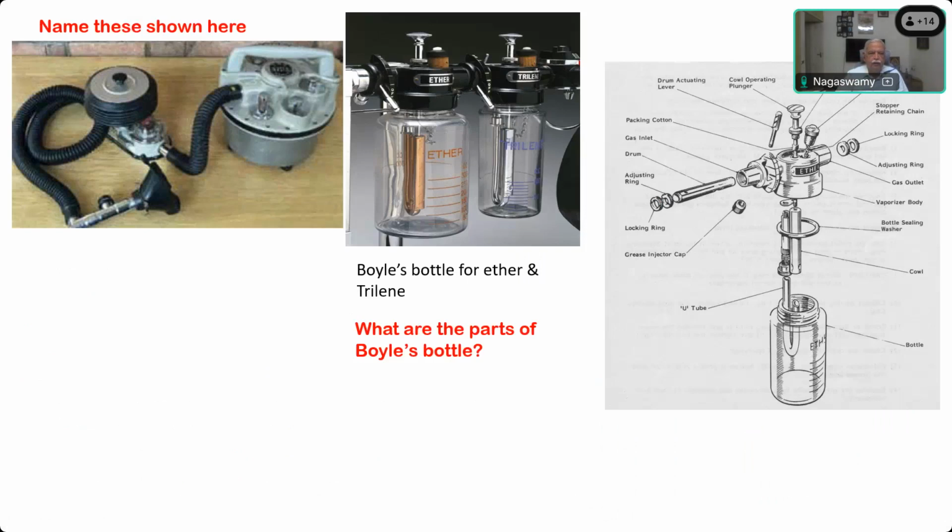Okay, so Oxford, but two persons who designed that were working in Oxford University. Who are those persons whose name is also incorporated into this machine? They are called Epstein and McIntosh. So these two are the anesthetists who designed this. As a loyalty to the university, they included the university name also, and this is called the Epstein McIntosh Oxford Vaporizer. And this is the vaporizer actually.